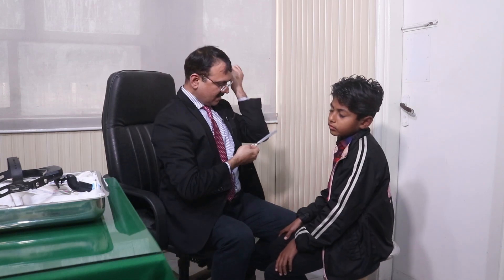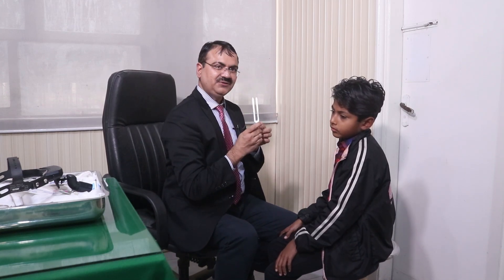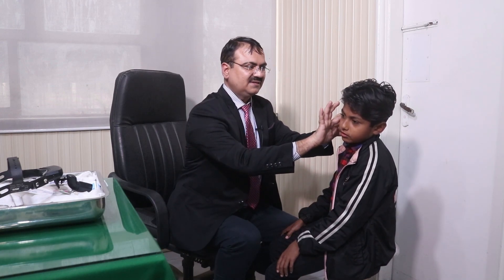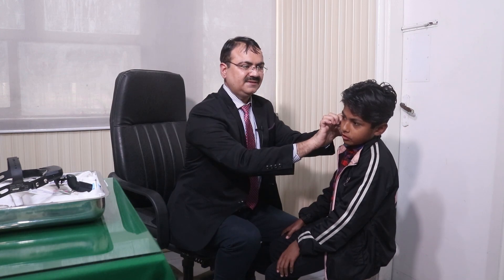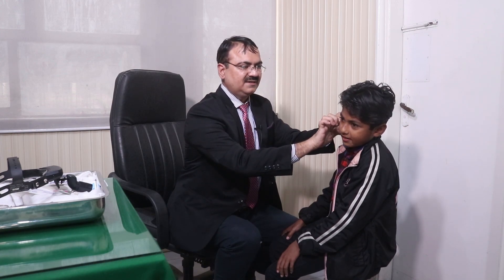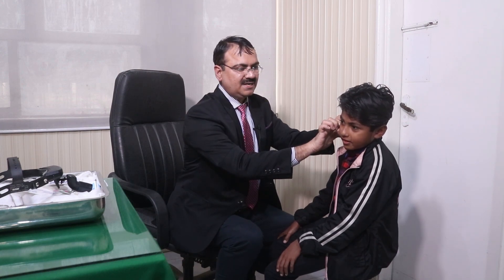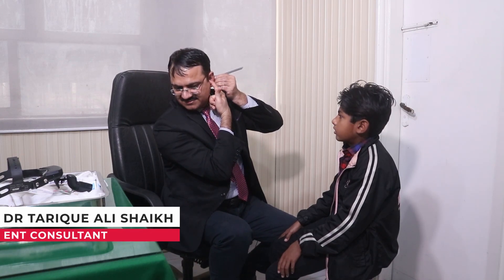In the ABC test, absolute bone conduction should be equal to the examiner's. Similarly, for the left side ABC, you have to feel the sound yourself, then block with your tragus. You have to block the canal with the tragus and compare it with the other ear. This is the tuning fork test — we have done it.